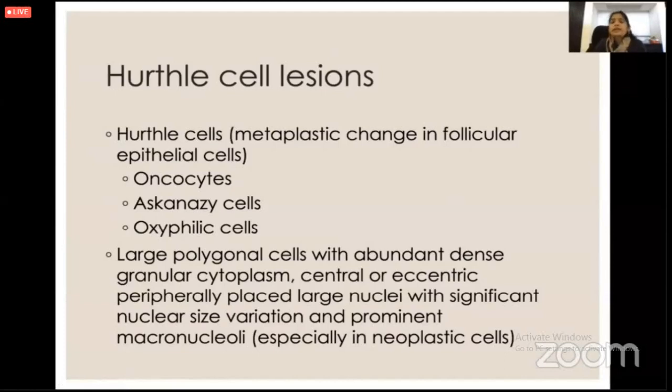Even if they're smaller lesions, they need to come out, because on follow-up, even if it's a Hurthle cell adenoma, somehow they have potential to come back again and metastasize, and we think that they have a different sort of biology. So if I start seeing a predominant population of Hurthle cells instead of follicular, I tend to tell that, and the clinicians are aware that they need to take out the lesion and, of course, explain to the patient in that way.